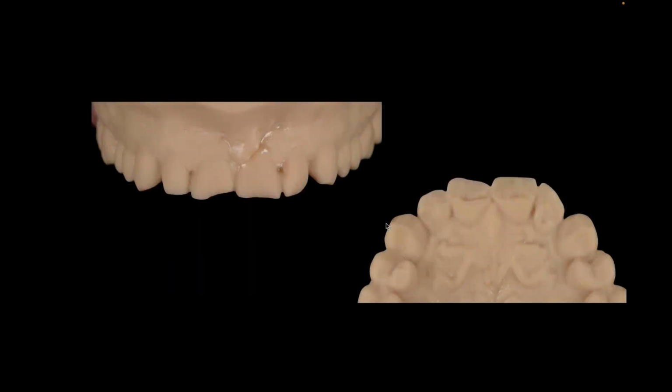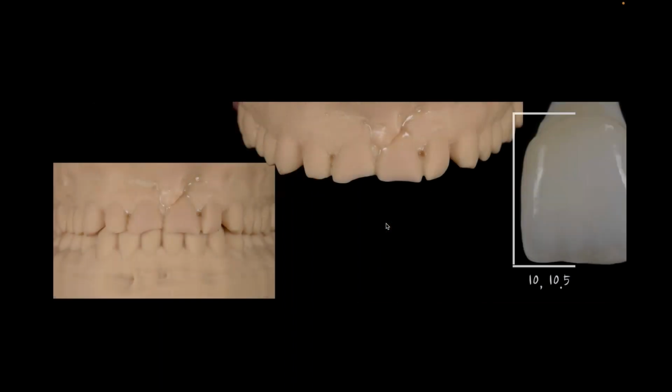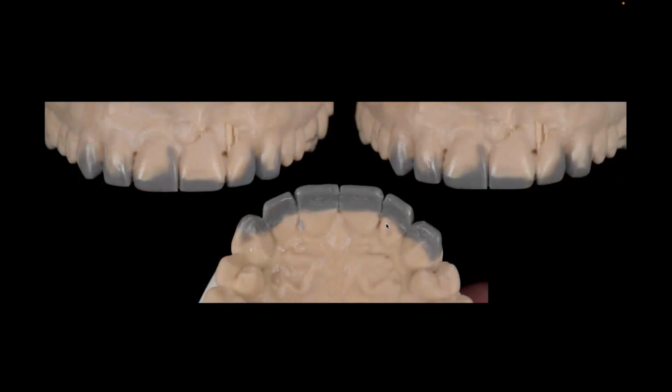So we took our digital cast. Here's a perfect great time for digital models. And I said, okay, let me make a 10.5 millimeter, 11 millimeter central. So I added some wax to the teeth. This is what we call a dirty wax up, really quick, not really paying much attention to it. I'm just trying to get to the length. And we were about 10.5 to 11 millimeters here.